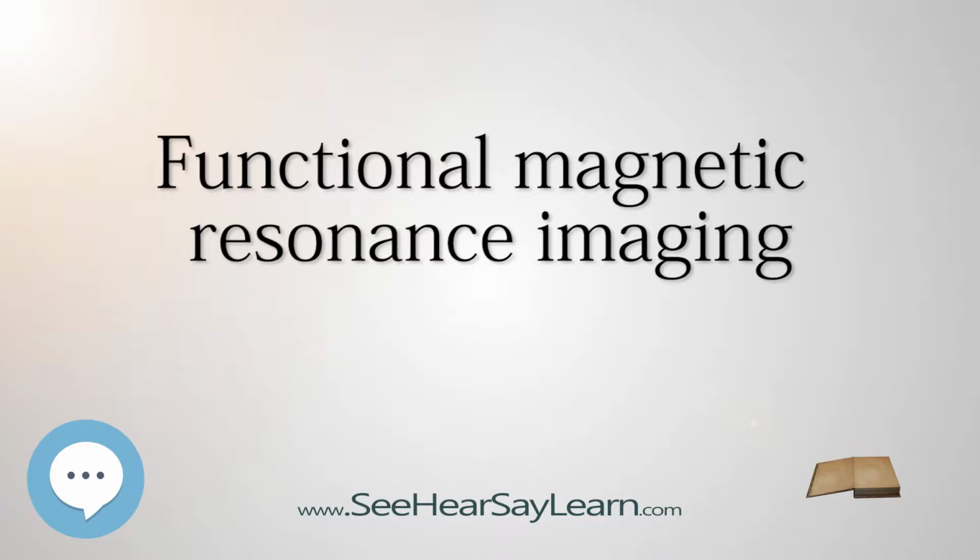The resulting brain activation can be graphically represented by color-coding the strength of activation across the brain or the specific region studied. The technique can localize activity to within millimeters but, using standard techniques, no better than within a window of a few seconds. Other methods of obtaining contrast are arterial spin labeling and diffusion MRI.